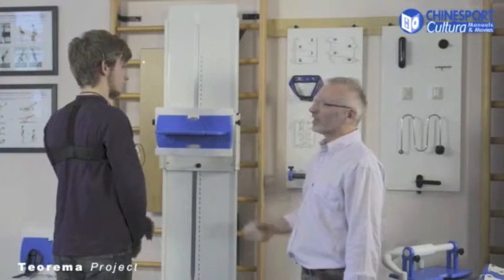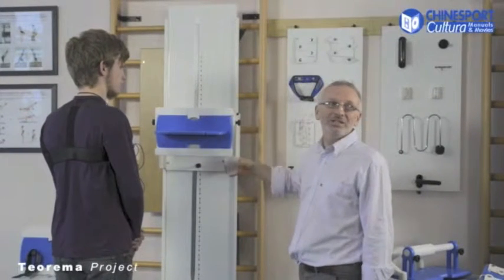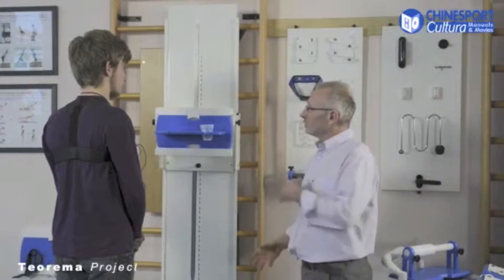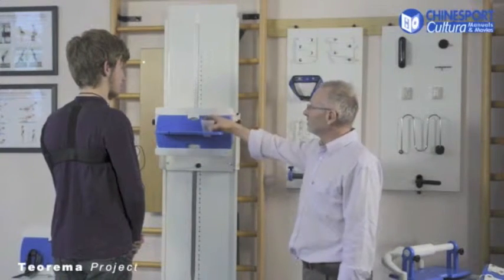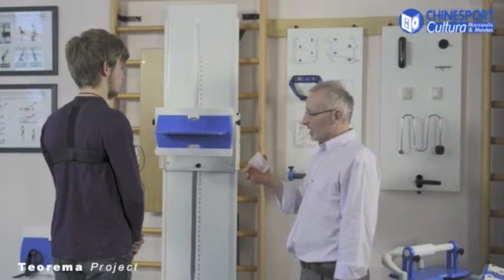This is therefore clearly a very functional task. Putting objects at different heights is part of daily life. The point is to always work on the quality of the movement, the fact that the patient practices making the movements, which are task-oriented. It's a goal in itself and an important aspect. Movement, day-to-day activity, emphasizing, reinforcing the activity and the movement is a factor that is commonly taken as a positive sign.